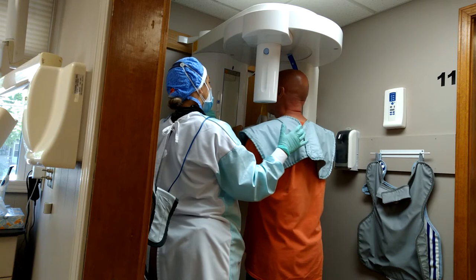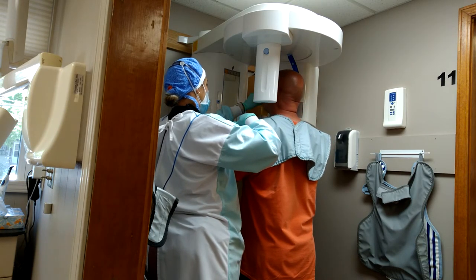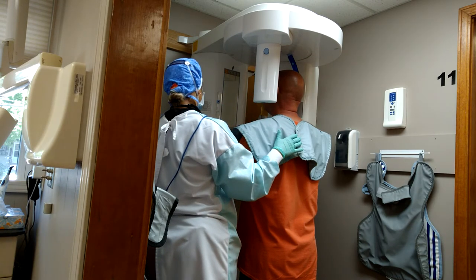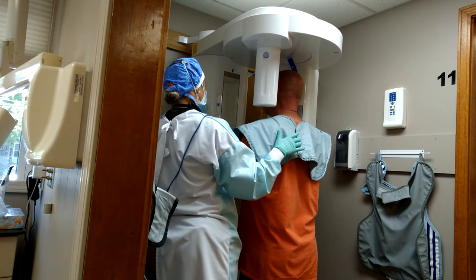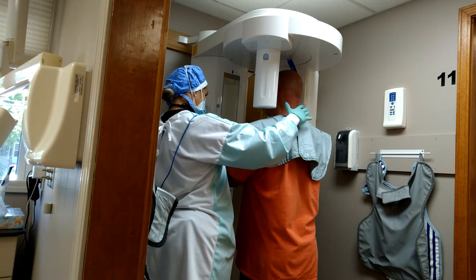You're going to bite right on this with your front teeth and you're going to slide back a little bit. Now what I'm going to do is — you're going to chin down like you're trying to look at your toes.